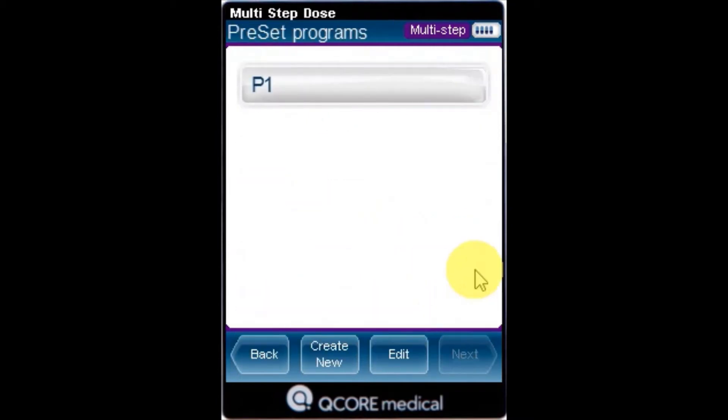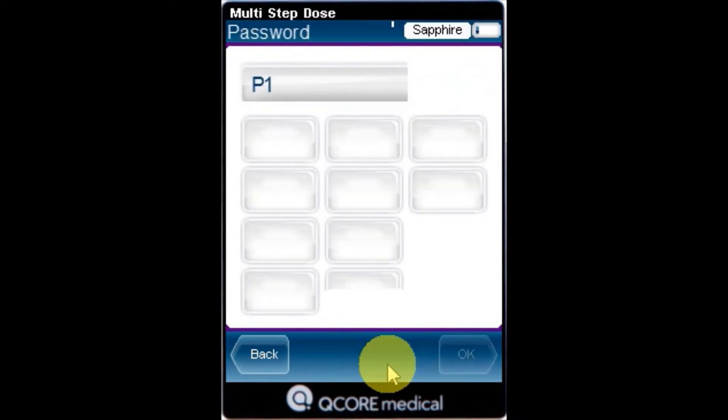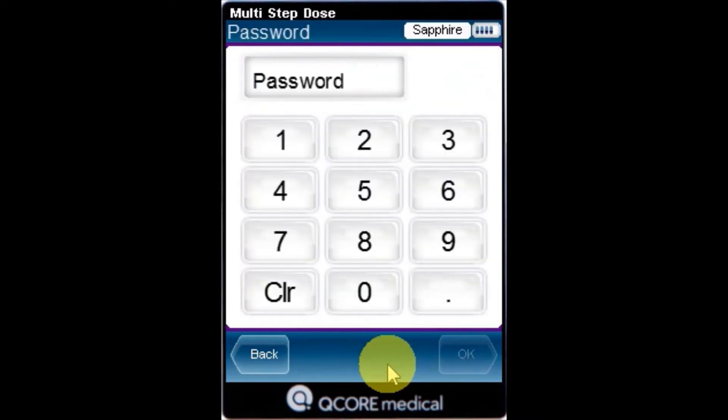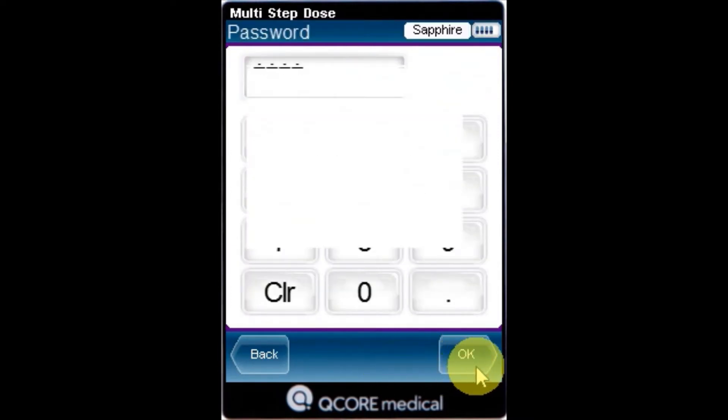From the toolbar of the Preset Programs screen, press Edit, and using the keypad, enter the appropriate password and press OK.